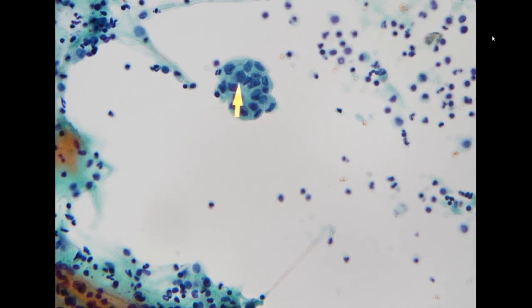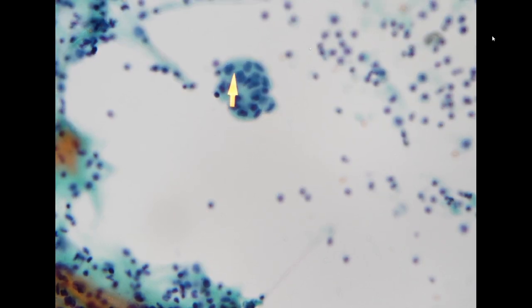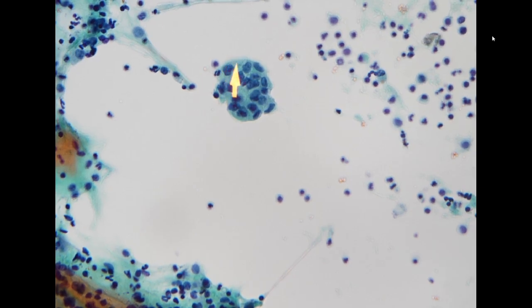This looks relatively bland compared to the usual pulmonary adenocarcinoma that we most commonly see. But the feature is that it usually forms a very tight three-dimensional cluster with a very obvious luminal border. The cytoplasm also shows quite abundant cytoplasm. Some might also show a little bit of mucin material.